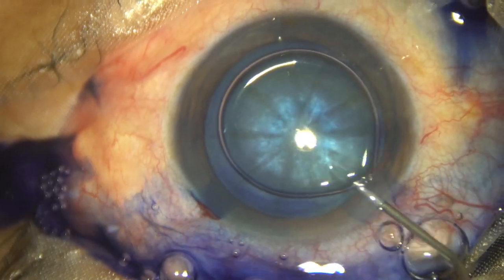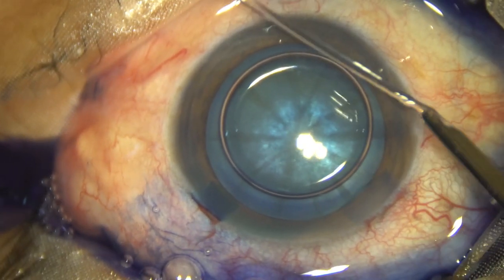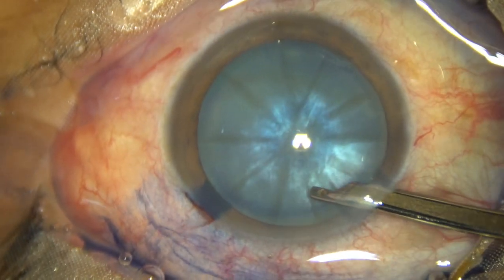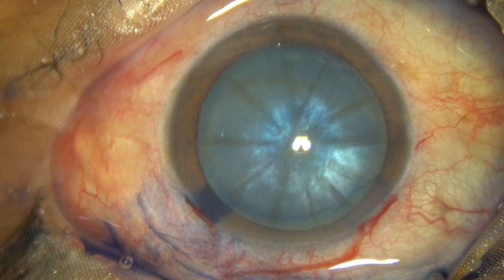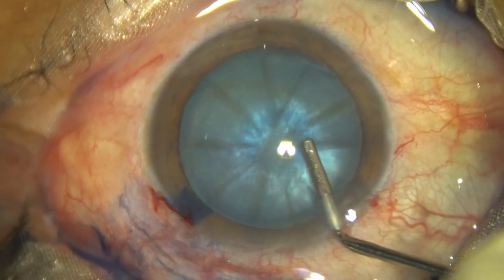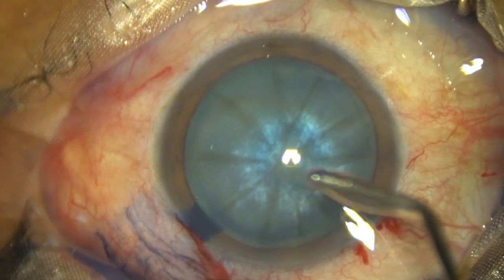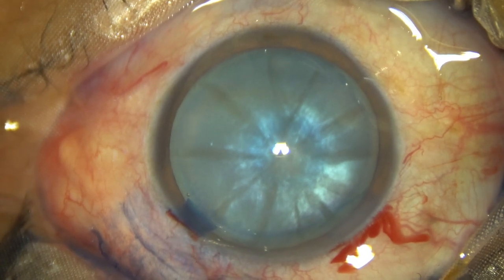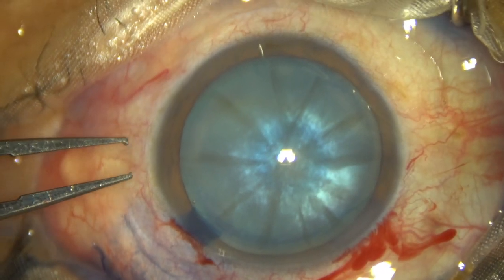This is a bit of adrenalin. And now the dye is washed out. Then, 2% hydroxypropyl methyl cellulose is injected to fill out the anterior chamber. In this case, with HPMC over the cornea, I am using Utrata forceps for doing the rhexis.